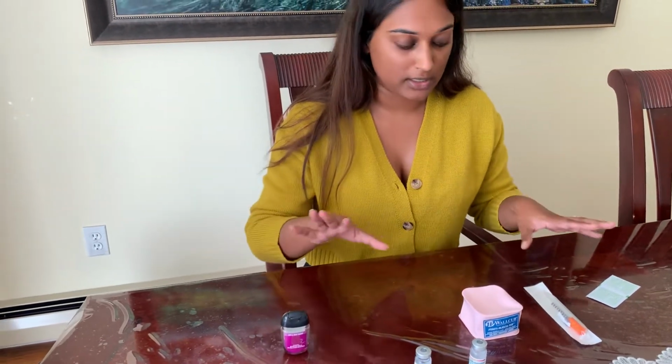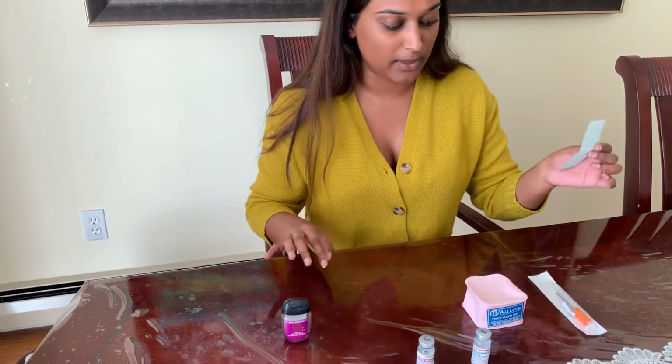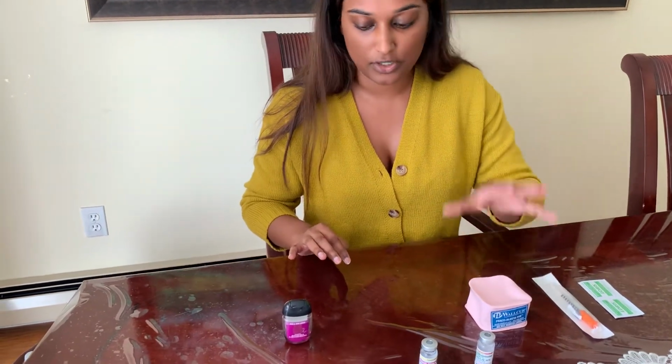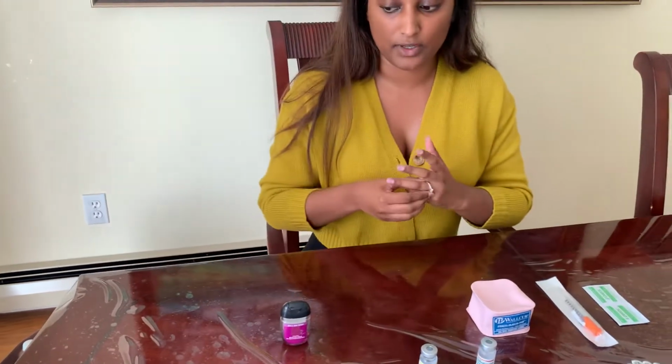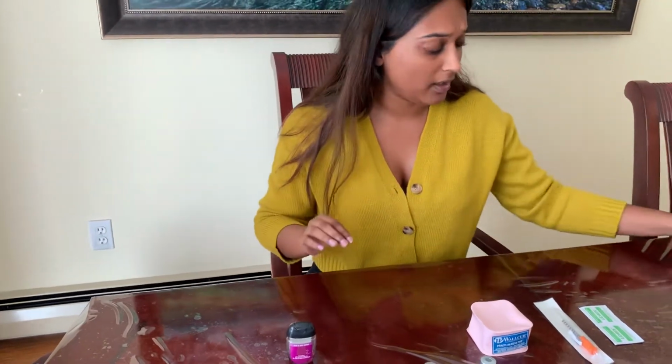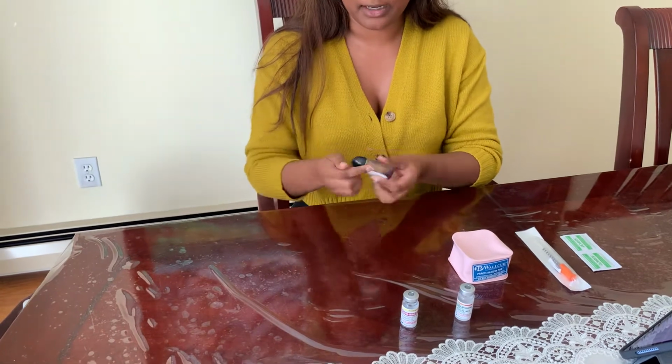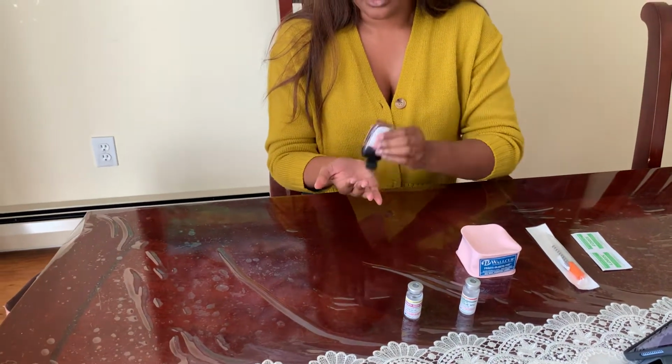But also, I don't know if I said it before, these are my alcohol pads to use, my syringe, my injecting pad, sanitizer, and my insulin vials. I'm going to take off my ring. I'm going to go ahead first and sanitize.